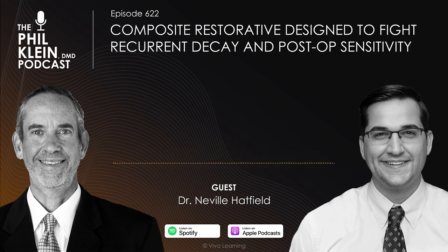The recurrent decay is always going to be an issue, right? I think there's plenty of statistics out there saying recurrent decay is the most common reason for composite bonding failure, and that still holds true as far as I understand it. Now, the research and development that all these companies have done has gotten so good in terms of the aesthetics, the color matching, and many other things that you can basically almost pick any composite on the market and get a very nice result.